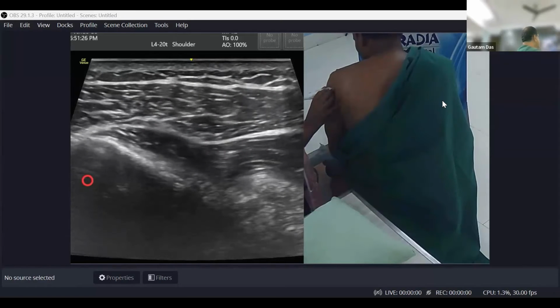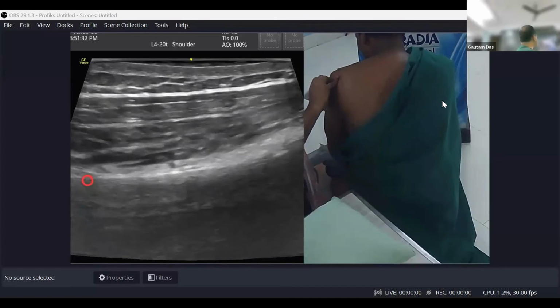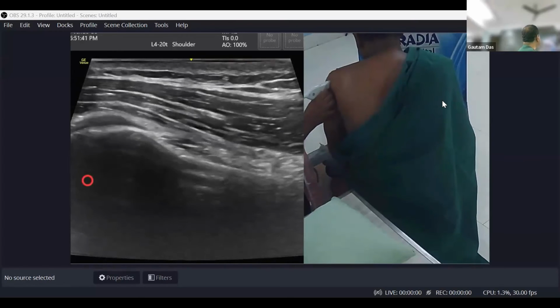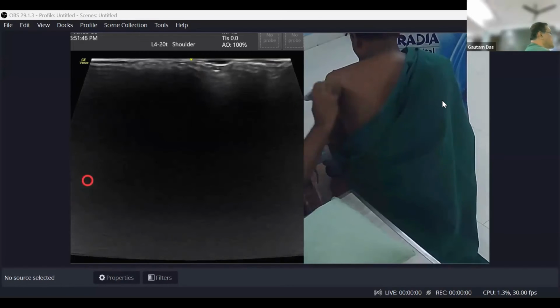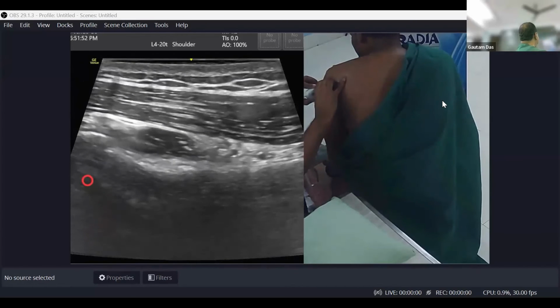And I have shown you two nerves. This nerve was in your quadrangular space. This nerve can be blocked here to block the axillary nerve. And to do the radiofrequency ablation, I'll be sending you a video of the radiofrequency ablation of the shoulder joint, this nerve.